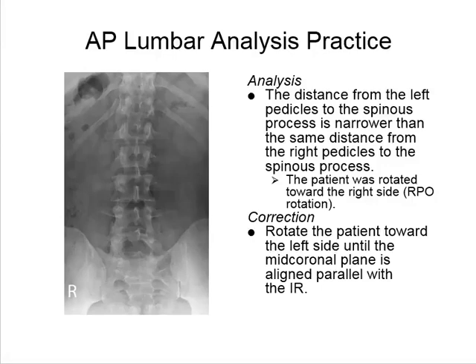All right, so we're going to finish up spines today. We're going to do L-spine, sacrum, and coccyx. So those are all the views that we're going to talk about. We're going to talk about obliques as well.